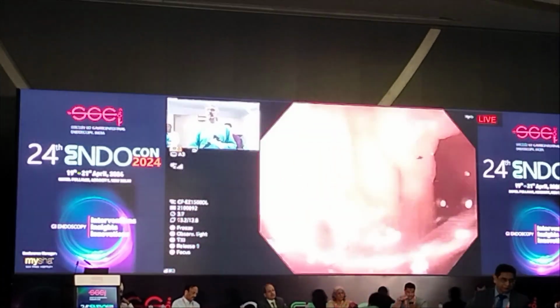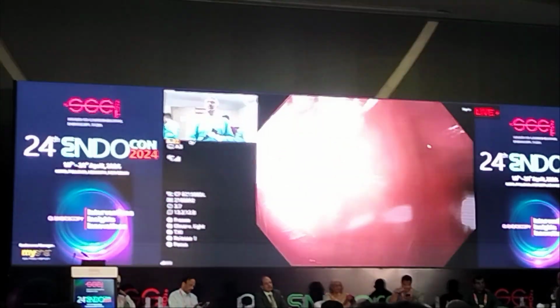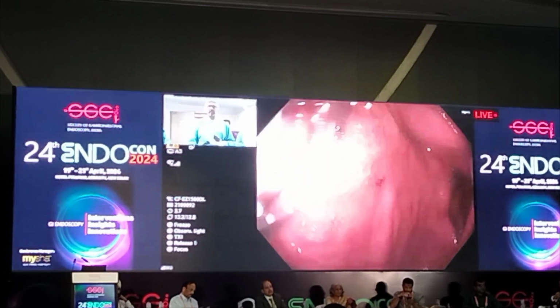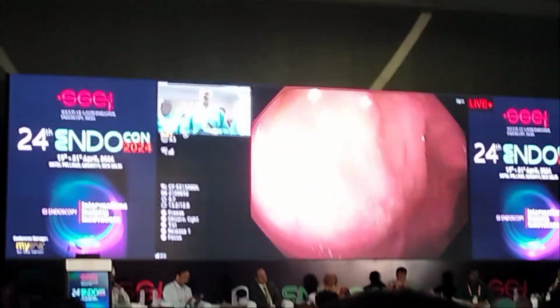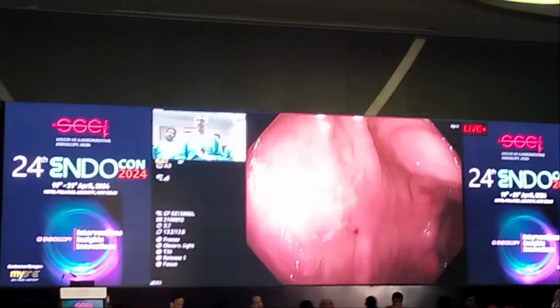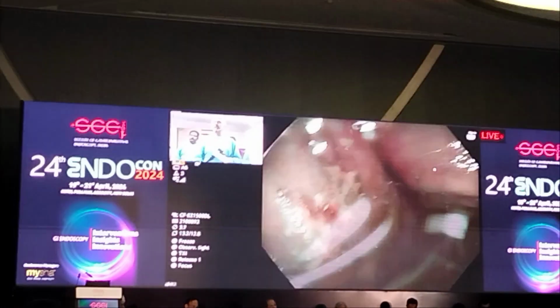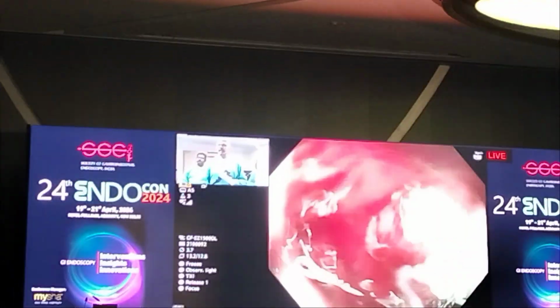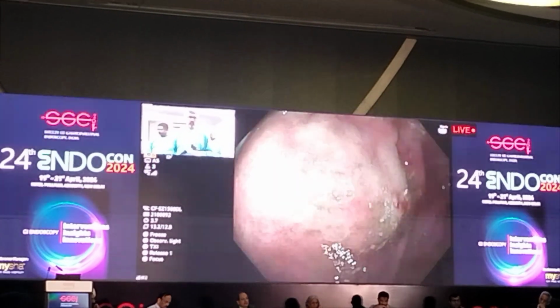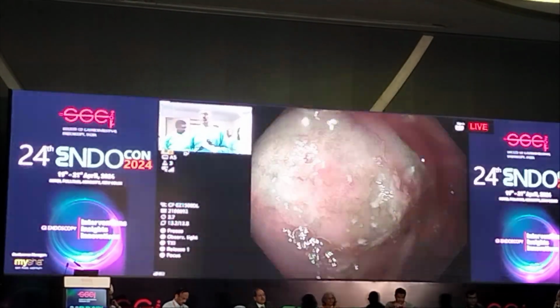And to me, we need to use our different modes of imaging. So I've got the Olympus 1500 series colonoscope that I'm using today, and that's got the capability of obviously the narrowband imaging, or NBI, which is, in my experience, equivalent to dye spray chromoendoscopy. So I don't tend to use dye spray chromo in my IBD surveillance patients.